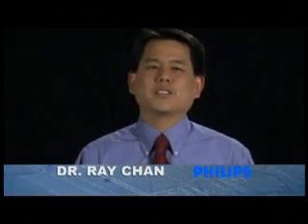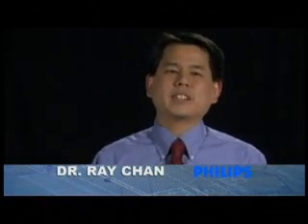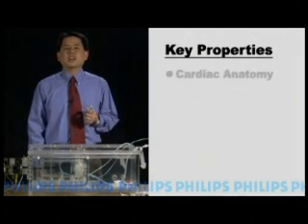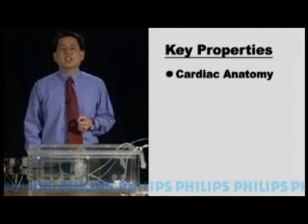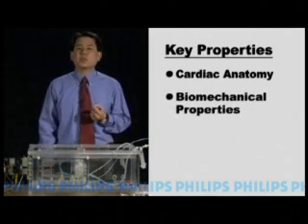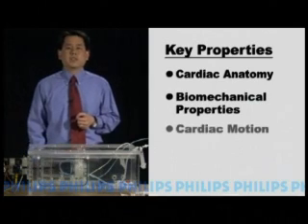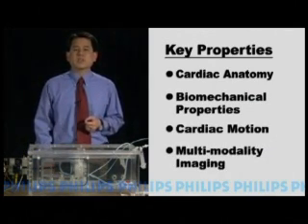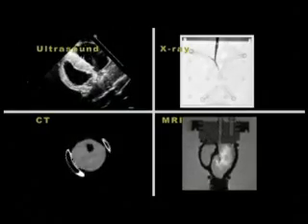You've seen a version of our multimodality dynamic heart phantom whose design specifications were chosen to meet the immediate needs of our research projects. These requirements were accurate representation of cardiac ventricular anatomy, a coarse representation of coronary vasculature and compression, as well as torsional modes of dynamic behavior. You've seen a demonstration of its use for ultrasound, X-ray, CT, and MRI applications.